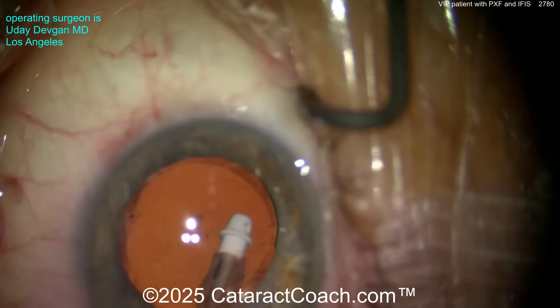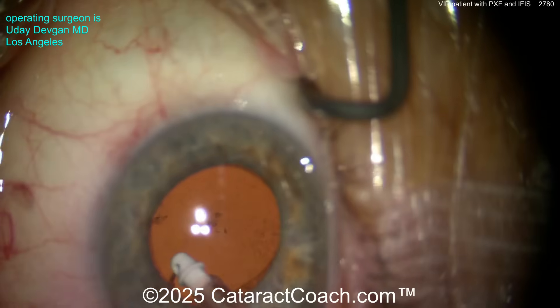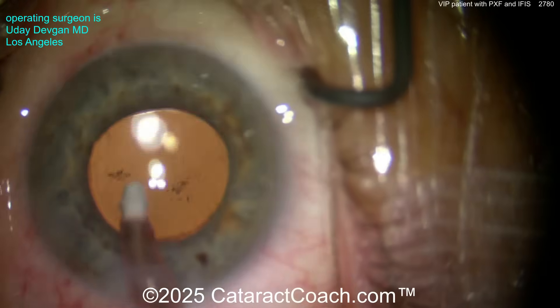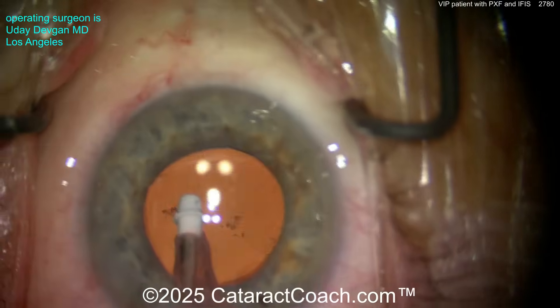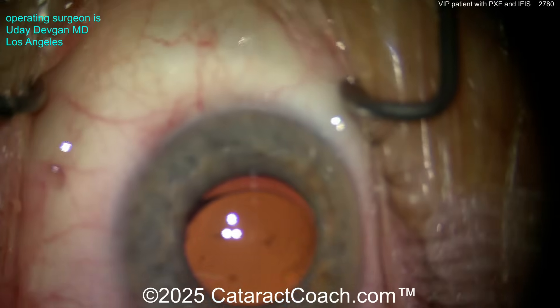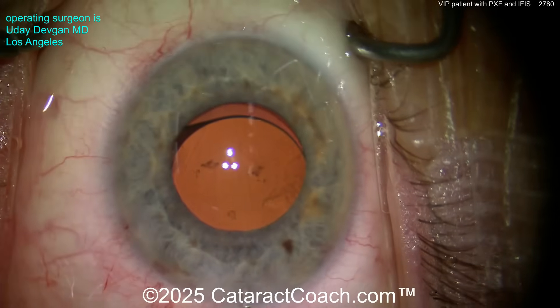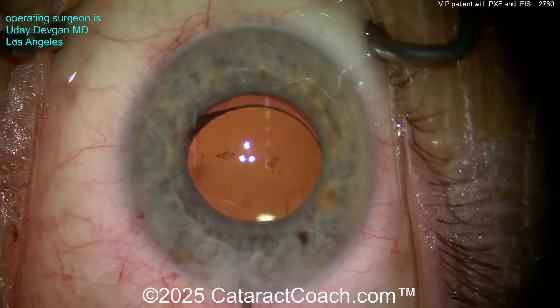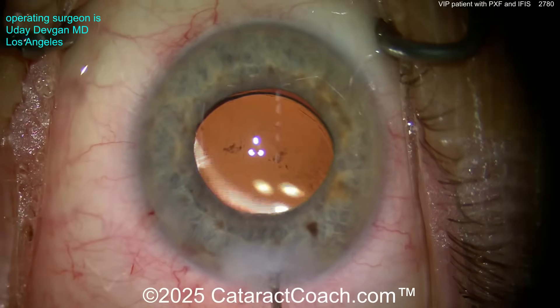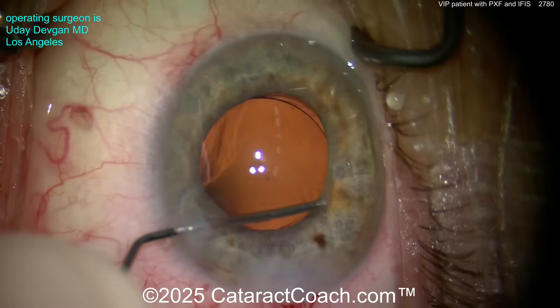We'll plan on doing this patient's YAG laser capsulotomy in a few months. This patient had 20/20 vision on post-op day one and was absolutely amazed and so thankful. Those few little spots on the posterior capsule are just a little too adherent — from the very aggressive 4-plus posterior subcapsular cataract — so we're not going to worry about it. Sealing up the incisions here — a beautifully constructed incision with that diamond keratome, so it's going to seal well.